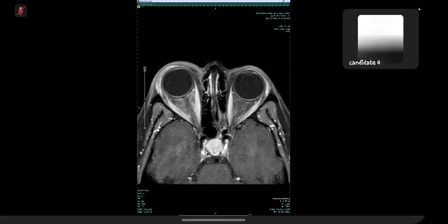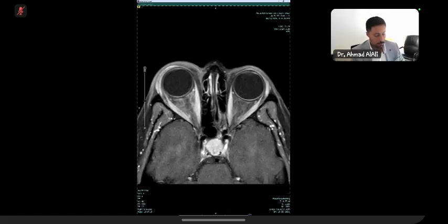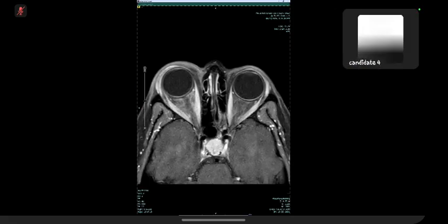The next step would be referral to the neurology unit, and I would suggest an ophthalmology review as well, and correlation with IgG4 levels, and response to corticosteroid treatment. So your primary diagnosis is orbital pseudotumor, is that correct? Yes, considering I would be focused on the clinical symptoms as well. If the patient has presented acutely with painful proptosis, then I would be thinking of an inflammatory etiology. The less likely possibility of a lymphoproliferative disorder is always there.